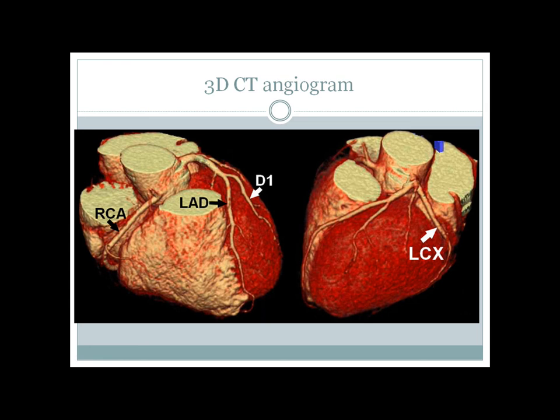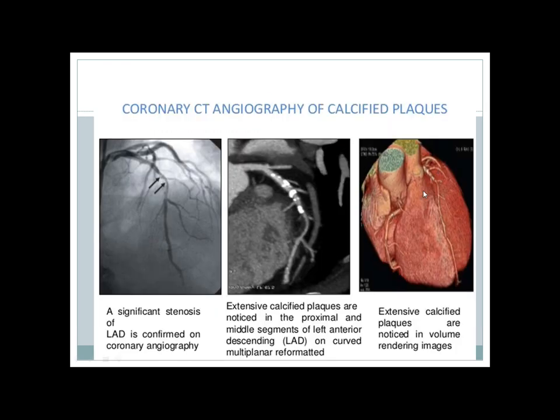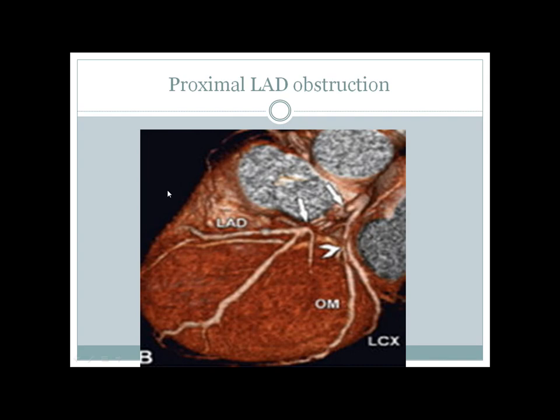If there is an obstruction it will show up in the CT scan. Here you can see that this CT scan shows the LAD is narrowed down and there are some calcified plaques in the proximal LAD, which is also seen as obstruction on the angiogram. Here is another image where you can see a proximal LAD obstruction — this is the left main coronary artery, and here the LAD is critically narrowed due to obstructing atheroma. This is the LCX running behind, and this is the first branch of the LCX known as the obtuse marginal branch.